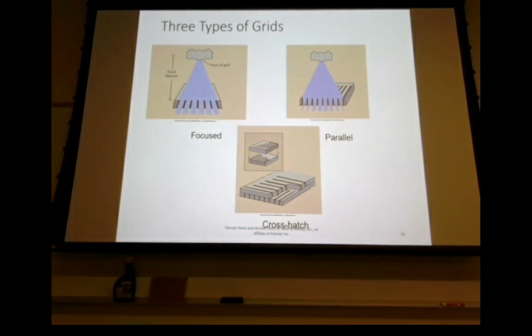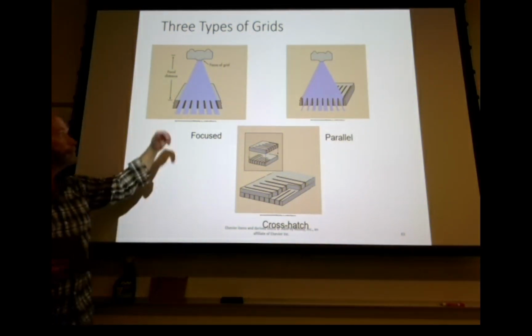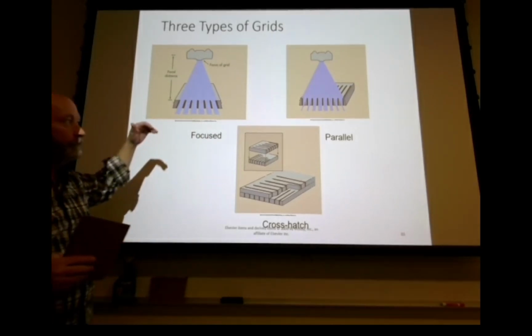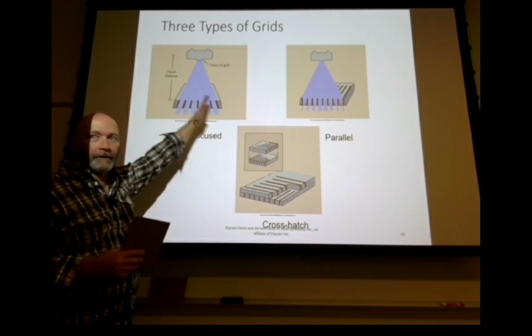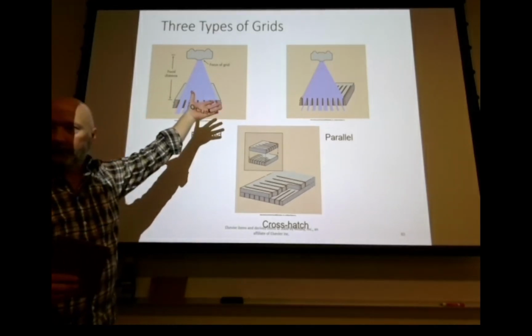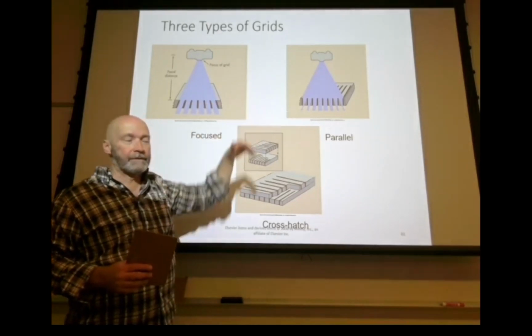Okay, so less positioning latitude, less likelihood that we're going to see any grid lines, but it does come with positioning complications. All right, so that's your focus grid. Has to be within a proper distance. Have to be centered to it laterally, right? Can't be inverted. Otherwise, you're going to get grid cutoff. You can't, in any of these, angle against the grid strips.